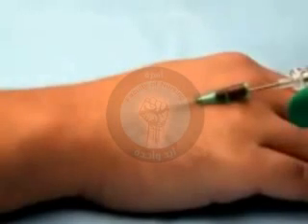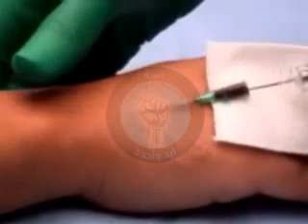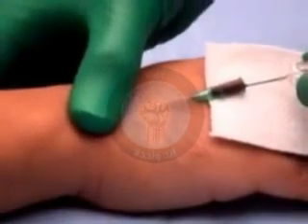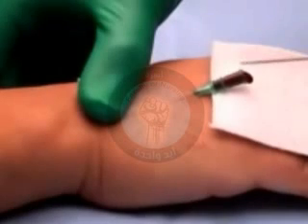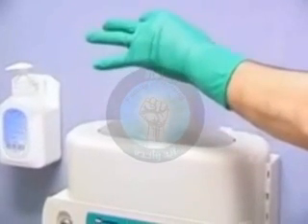To prevent blood loss from the open plastic cannula hub when the metal needle is removed, place direct pressure over the vein proximal to the end of the catheter, and place a gauze pad beneath the cannula hub. Remove the metal needle from the plastic cannula and place it in the sharps container.